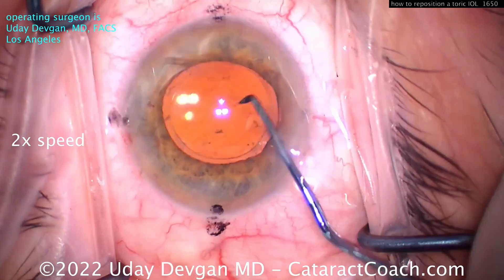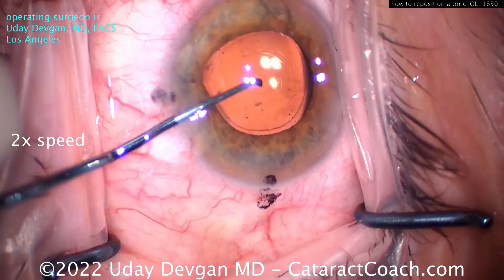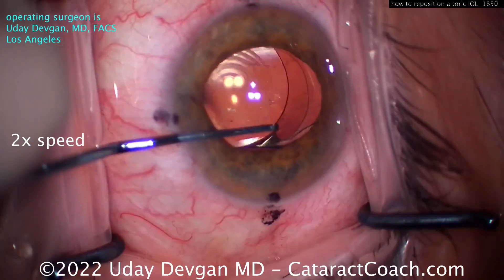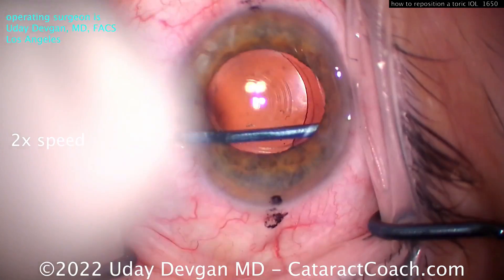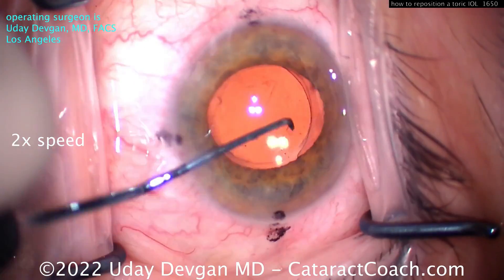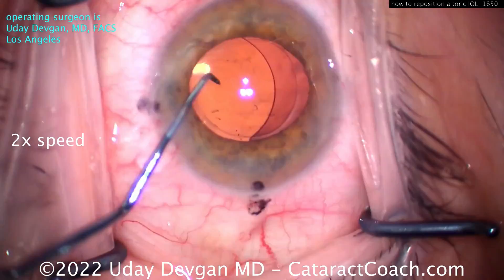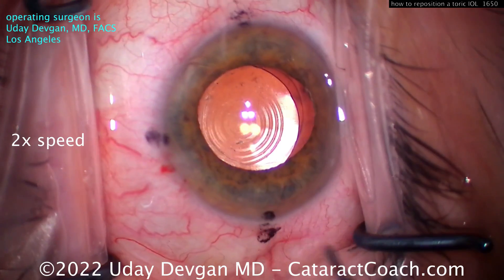Now we can re-rotate the lens. If there's any resistance, spend the time to do a little more dissection. Notice how we do this completely through just the two paracentesis incisions. I'll use the spatula again to make sure it's fully opened up — I felt some resistance there and I don't want to damage things. Now it's opened up.